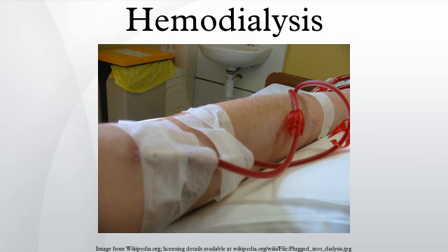Although many clinics outside the USA use this method, some clinics are switching toward a more automated, streamlined process as dialysis practice advances. The newer method of automated reuse is achieved by means of a medical device which began in the early 1980s. These devices are beneficial to dialysis clinics that practice reuse, especially large dialysis clinical entities, because they allow for several back-to-back cycles per day. The dialyzer is first pre-cleaned by a technician, then automatically cleaned by machine through a step cycle process until it is eventually filled with liquid disinfectant for storage.